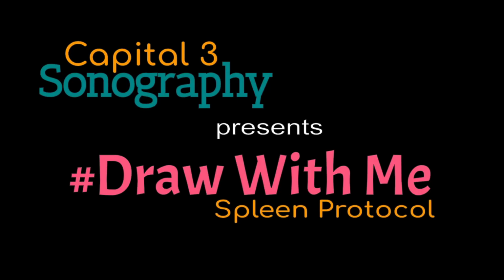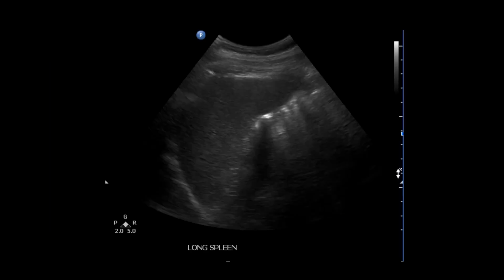Hello everybody, Capital 3 Sonography with our series Draw With Me, the spleen protocol. This video will cover the two basic images needed to image the spleen in a basic ultrasound protocol, as well as looking at how to measure and some other tips and tricks.